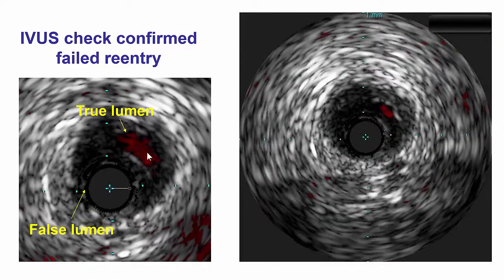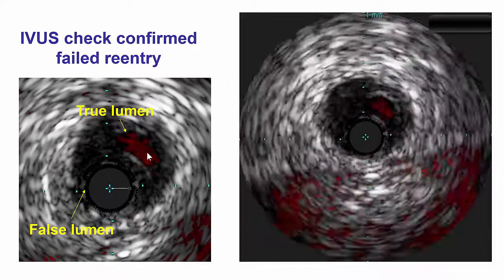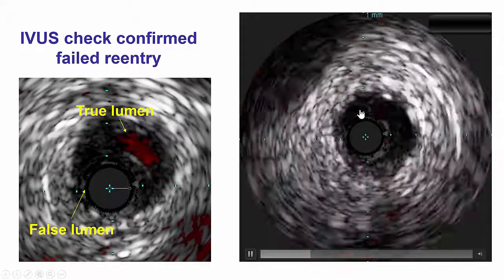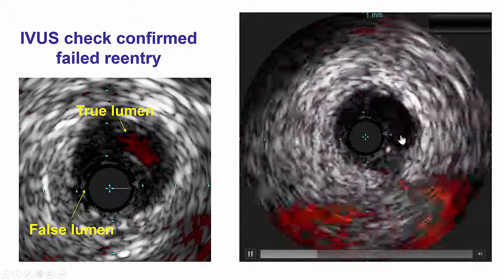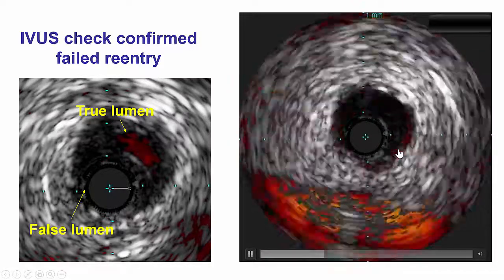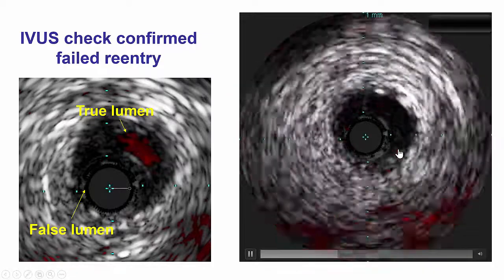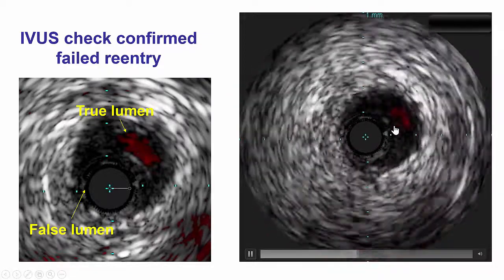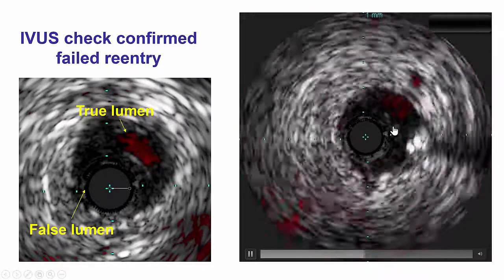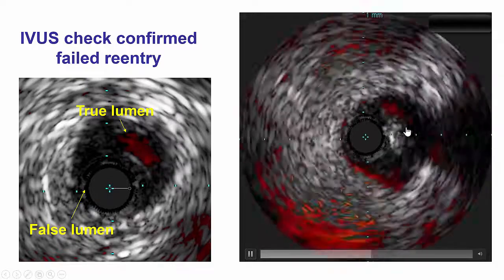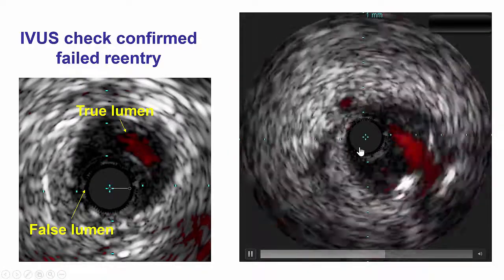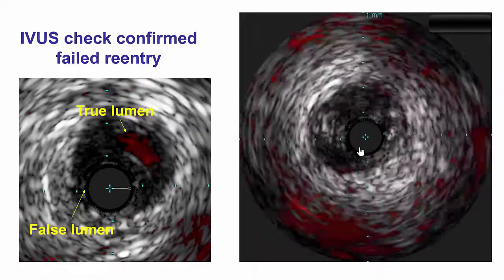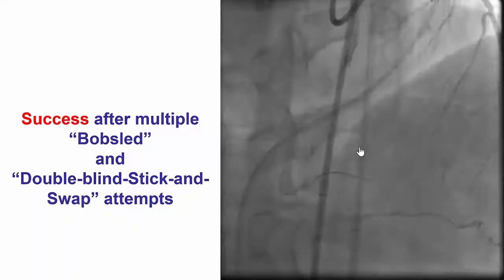That is an important thing to keep in mind. We do not want to put stents in this position, because then the chance of recanalizing the vessel would be very slim — there was no retrograde option here anyway. So whenever there is doubt as to whether distal true lumen entry has been achieved, doing IVUS can be a very useful way to confirm wire position.